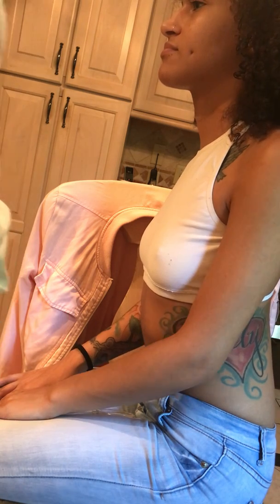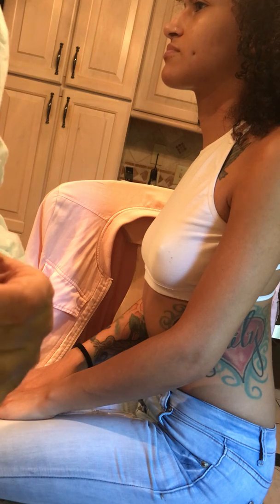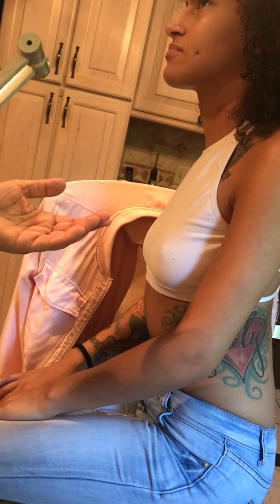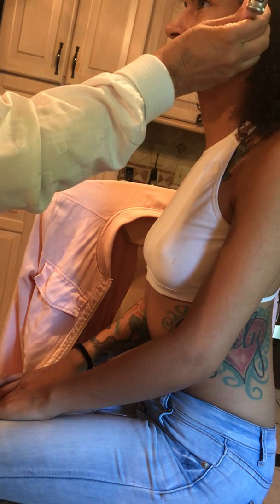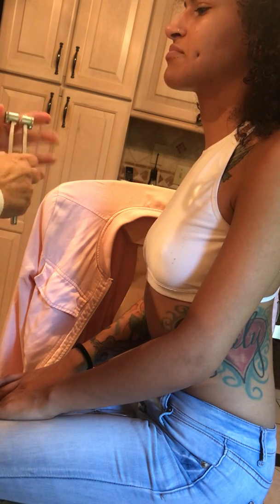I'm also going to assess the Weber and the Rinne test. I'm assessing for air and bone conduction. Aubrey, just let me know which ear you feel this out of. What ear do you feel that out of? Can you feel that? Tell me when the sound stops.